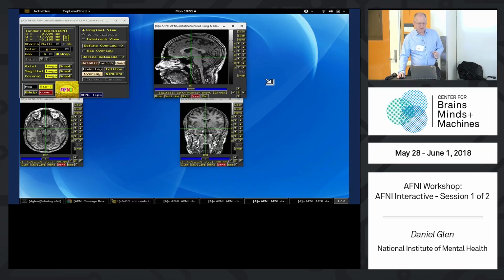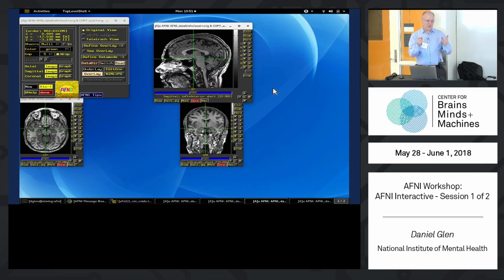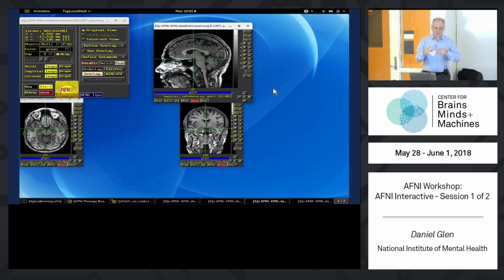If you have, I think on Macs, you can resize it and squash it. Can you do that? It'll be kind of weirdly squozen. Yeah. So if you do that, and on Linux it doesn't allow me to do that, but on Mac systems it doesn't respect the X11 requirements as much.